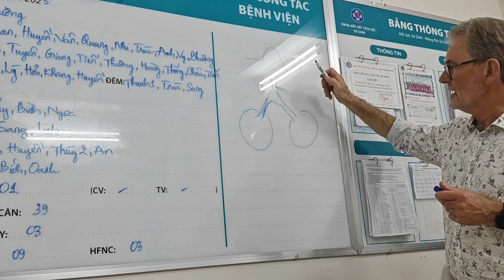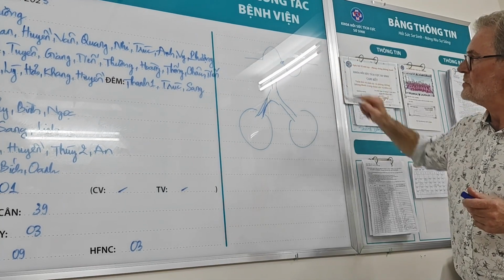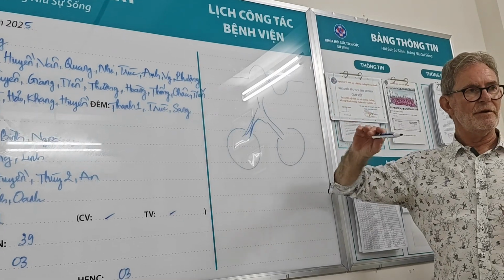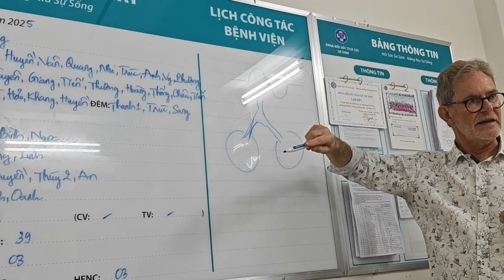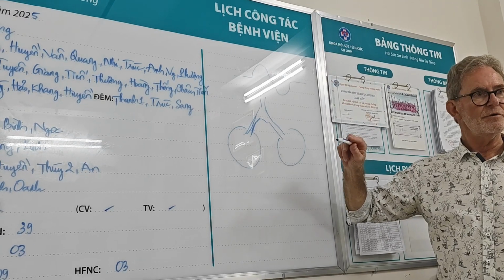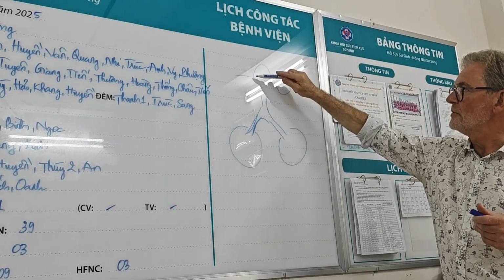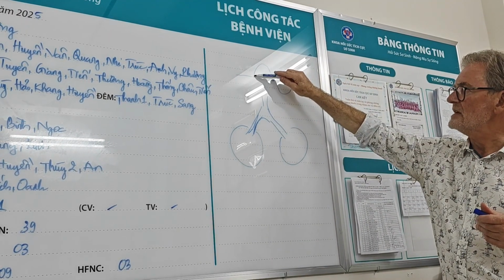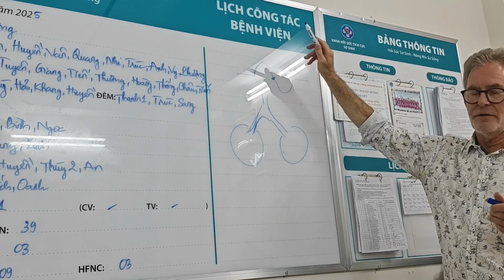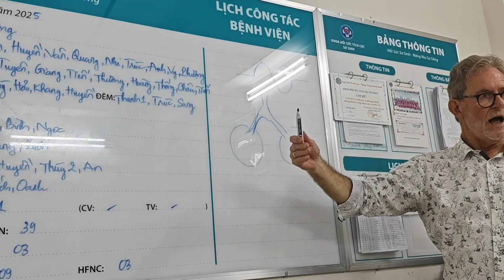see this point here is really important. When you look at the curves on the ventilator, look at the pressure flow curve. You see as the lungs start to fill, the flow is high.